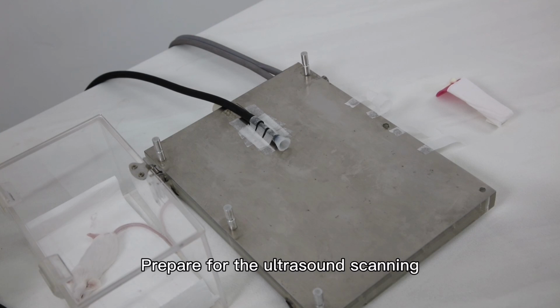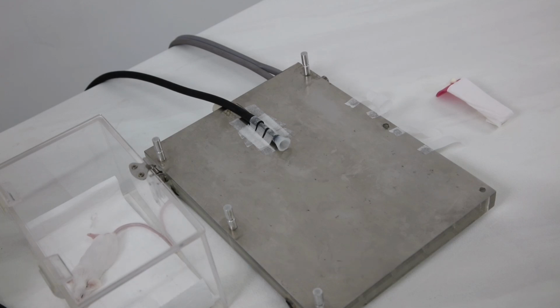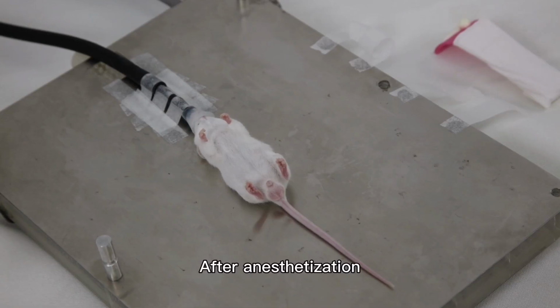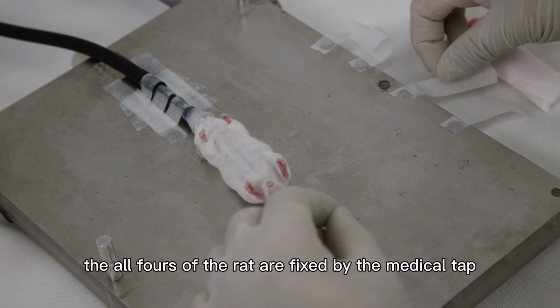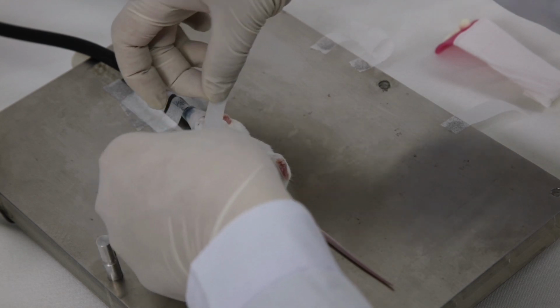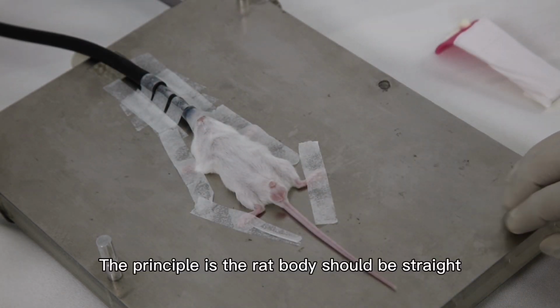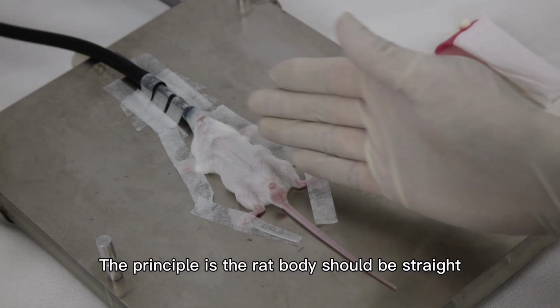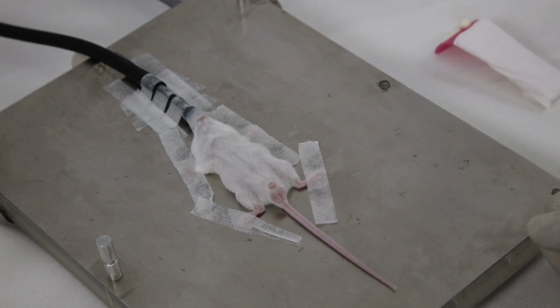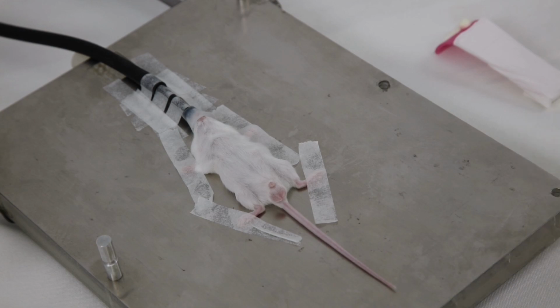Prepare for the ultrasound scanning. Take a rat as an example. Anesthetize the rat. After anesthetization, the four limbs of the rat are fixed by the medical tape. The principle is that the rat's body should be straight, without twist, with proper tightness. Forelegs are not stretched excessively.